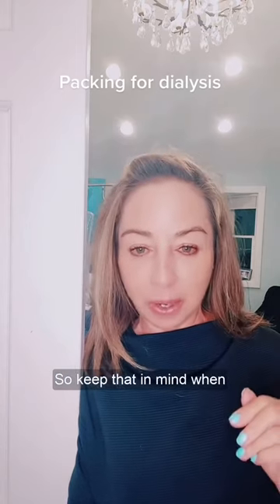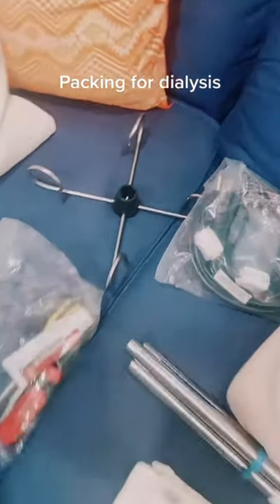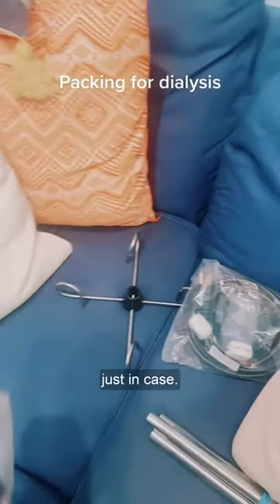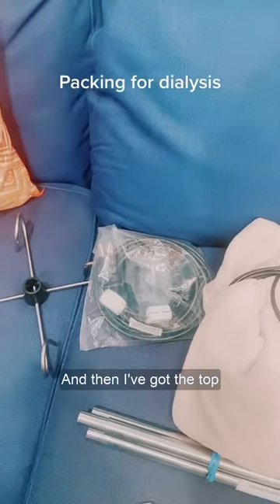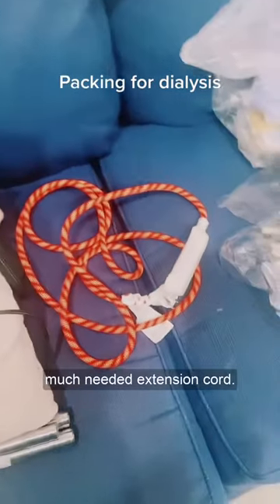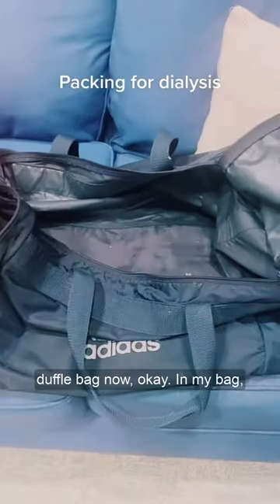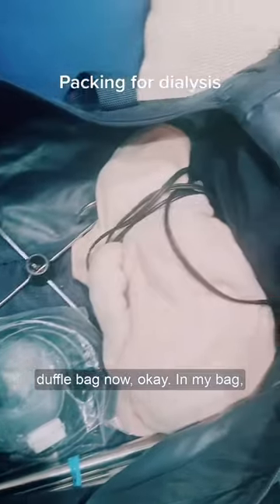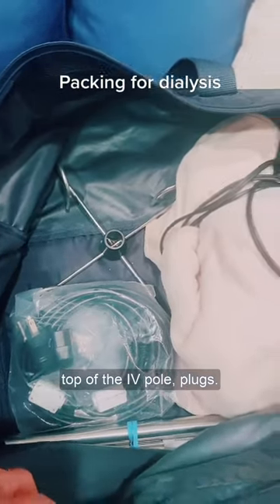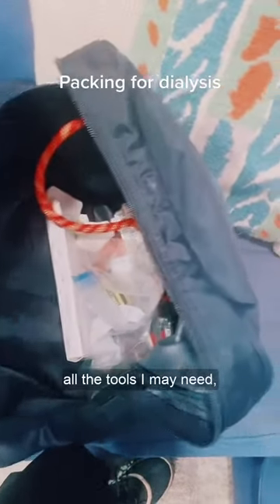These are the things I know I'm going to put in the bag. I always say it's good to bring scissors and a screwdriver, that kind of stuff, just in case. I've also got the top for the warmer, an IV pole, my heated blanket, and my much-needed extension cord. So I'm going to start putting all of that in my duffel bag — heated blanket, IV pole, top of the IV pole, plugs, extension cord, and all the tools I may need.